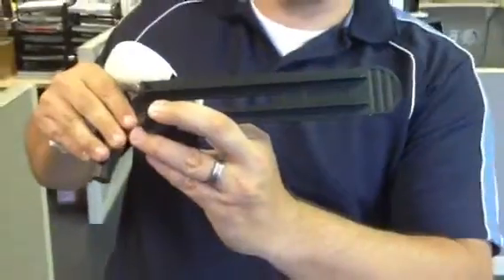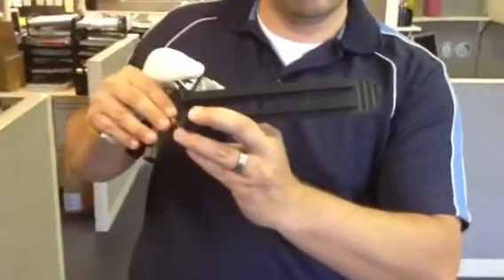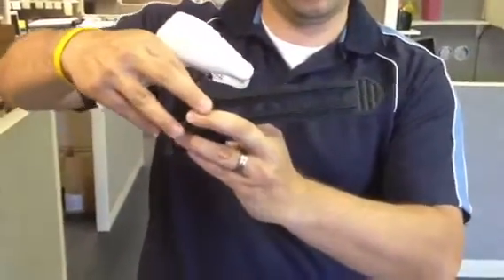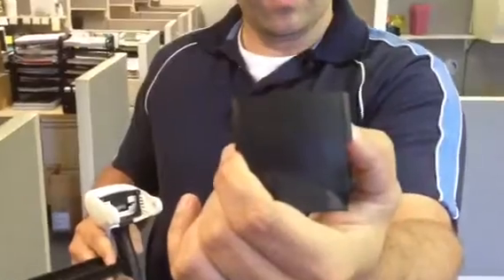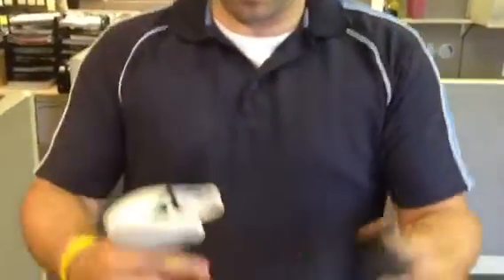So we've got the plunger that's 1 to 1, 2 to 1. Can you read it? Basically the ends are about the same — one's a little smaller than the other. And then we have the little top part that's 1 to 1, 2 to 1. And we've got the gun.